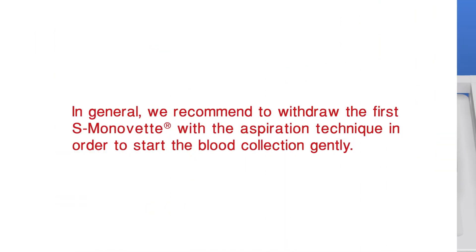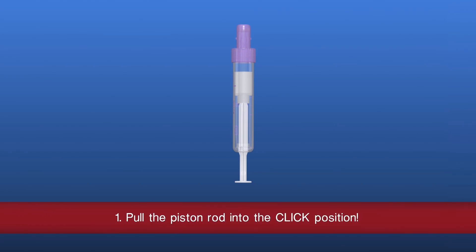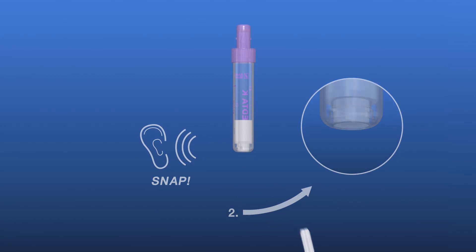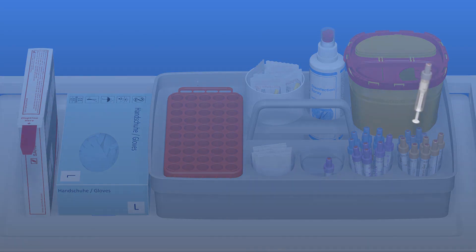In general, we recommend filling the first S. Monovet using the aspiration technique so that blood collection starts gently. Prepare the second and all additional S. Monovets for the vacuum technique by pulling the plunger all the way to the end until it audibly clicks into place, then break off the plunger. Prepare the next S. Monovets in the same way.